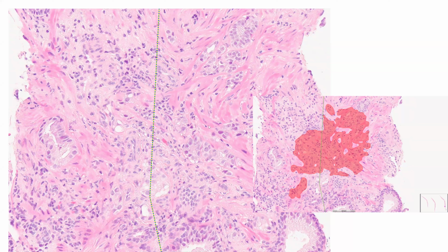So I was pretty happy that if you were using this tool, you could review the score, see the areas that were scored 5, put on the overlay and see what it was calling 5, and then adjust your scores accordingly. Thanks, John.